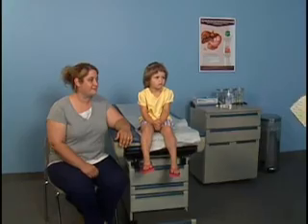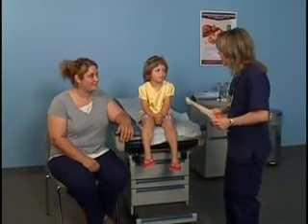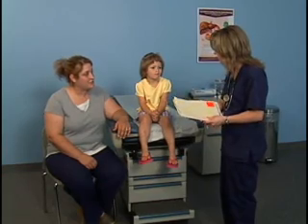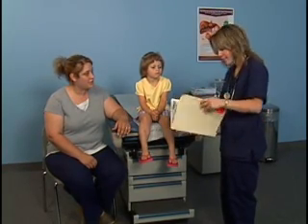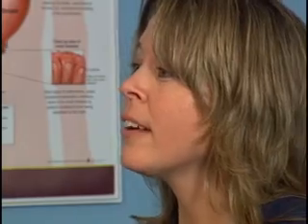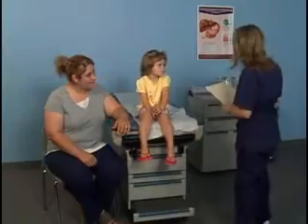Hi, my name is Kim, and I'm going to be your medical assistant today. Could you please tell me your full name and your daughter's full name? Identify the child's mother and her daughter and explain the procedure. Hi, Kitty. How are you doing today? I need to take her temperature today.